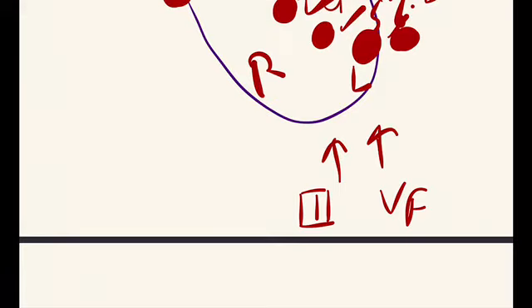So if there is any infarction from below, then lead 3 and VF will show an abnormal Q wave. Now this is important, guys: if there is an infarction in the posterior wall of the left ventricle, we do not have any lead which is looking at the posterior wall of the left ventricle.